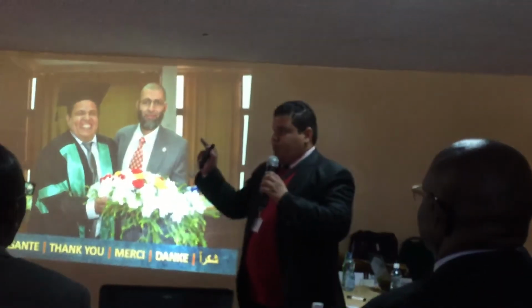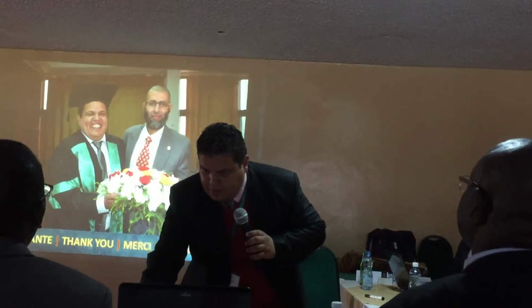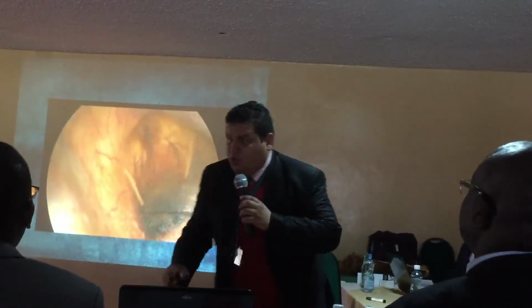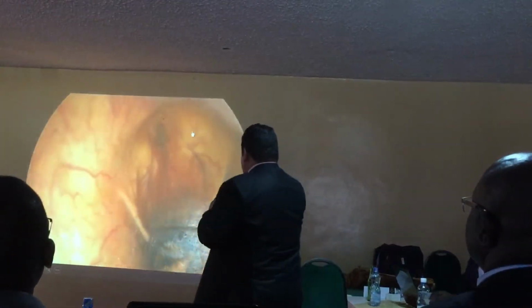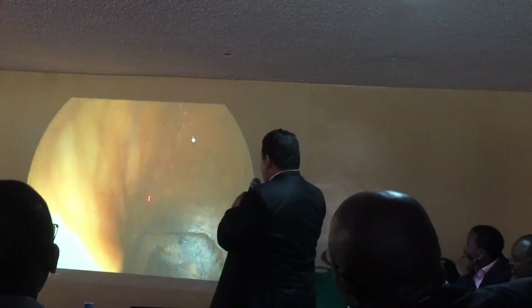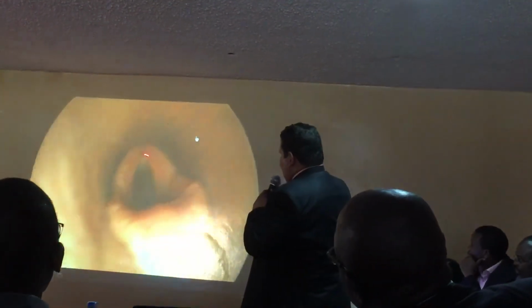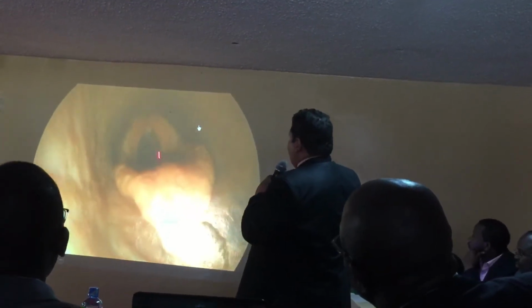Just a minute. I have some video in live animals. This is a video visualizing in the live animal. This is the opening of the cartilaginous flap. This is the dorsal pharyngeal recess, the epiglottic fold, and epiglottis, corniculate process. This is the vocal fold.